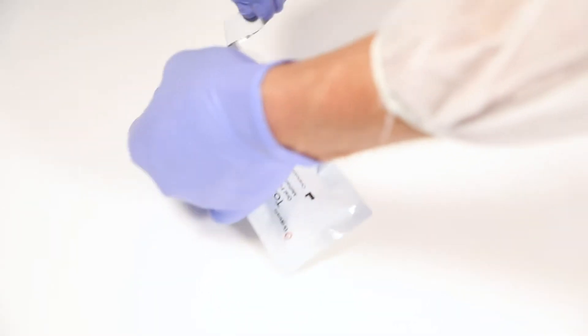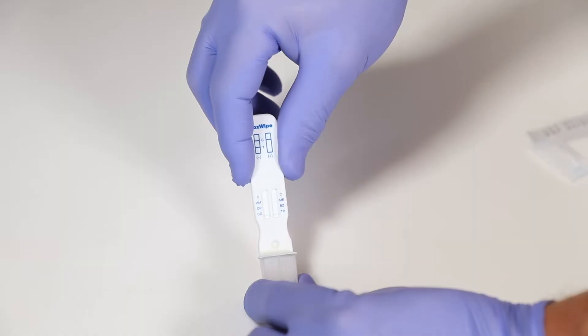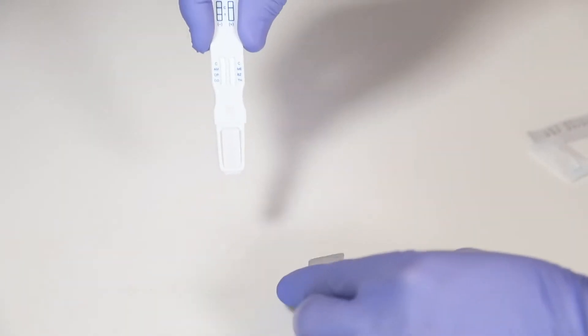Then open the pouch and pull the toxwipe out of the buffer cap. Make sure not to touch the sample pad area while doing so. Place the sample pad end of the toxwipe into the subject's mouth.